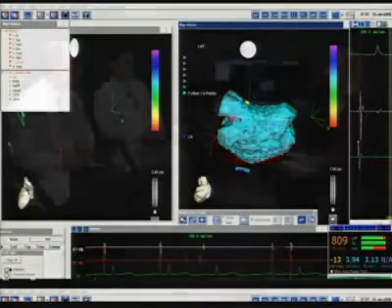How many people are in the OR or in the lab for this procedure? It depends on the case. Sometimes Dr. Savell and I will both be in there, and then there'll be two nurses usually, and then a monitor. And then there's also a technician from the company that runs the 3D mapping technology who helps us create the map. So usually 5 to 6 people.